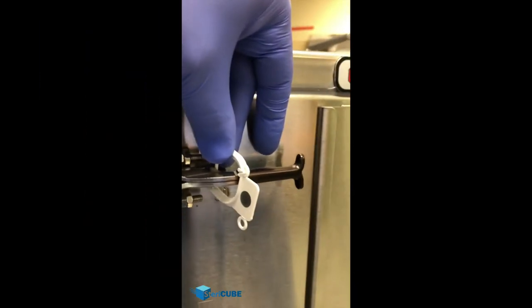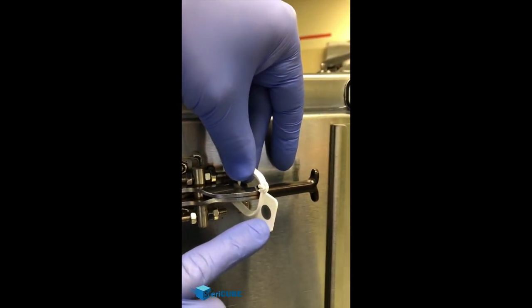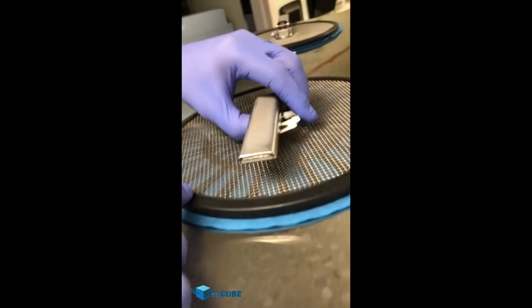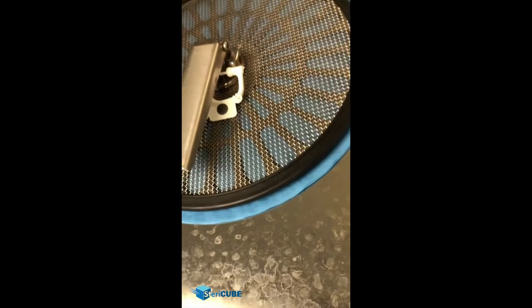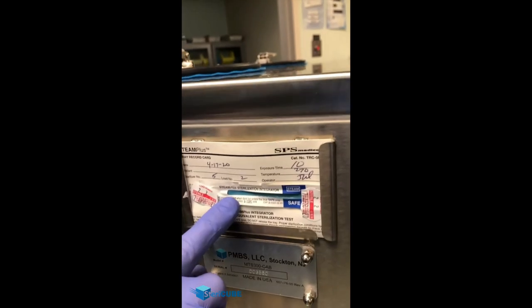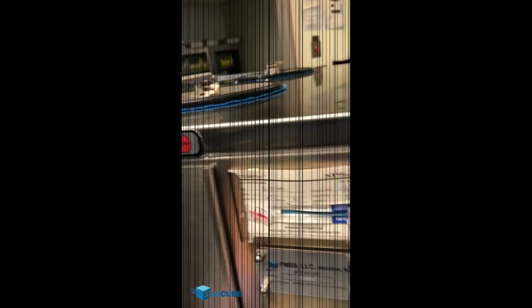After sterilization, we do want to check our indicators to ensure it processed properly. You can see on our integrity lock the color has changed. Look at the retaining plate and make sure the integrity locks have changed there. You also want to see blue from the filter all the way around the circumference of that retaining plate. Check the data card in the upper right and look at the integrator — make sure that it's changed all the way into the safe zone to indicate that it was processed properly.